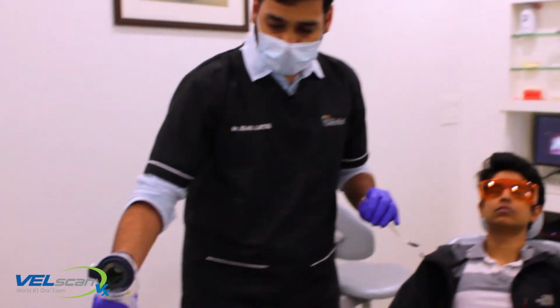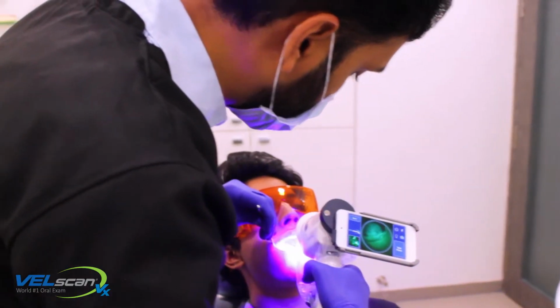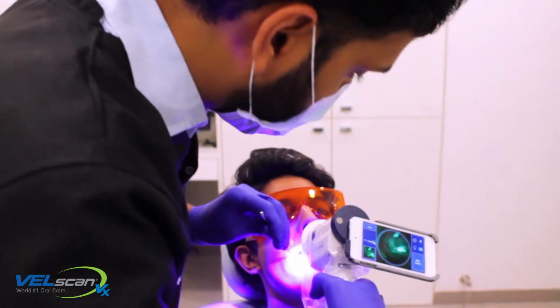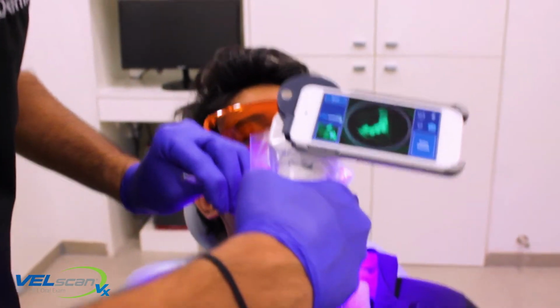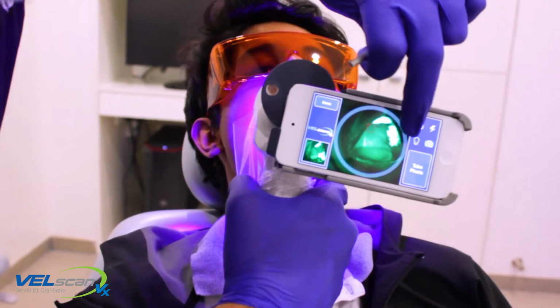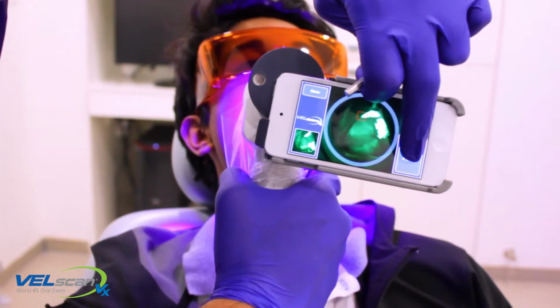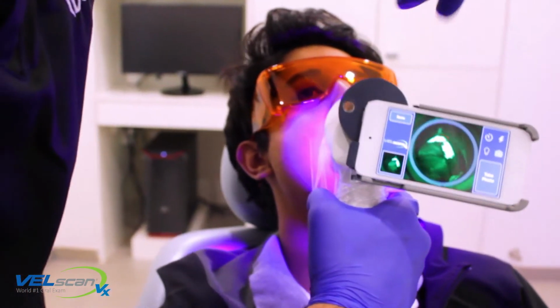What happens next? So we are going to scan all the soft tissues, the buccal mucosa bilaterally, the floor of mouth, the tongue, the labial mucosas, the hard palate and the soft palate. If at any point we feel that there is loss of fluorescence, we can actually capture it and store it for our further references.